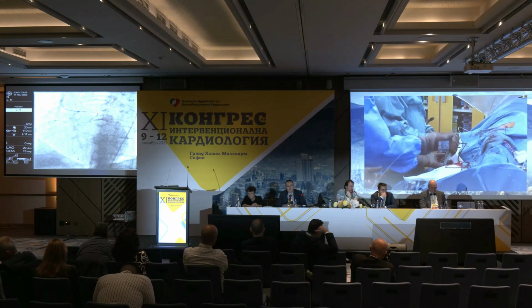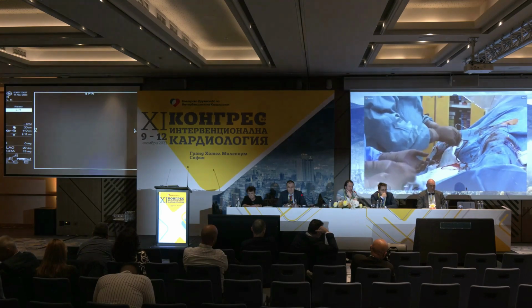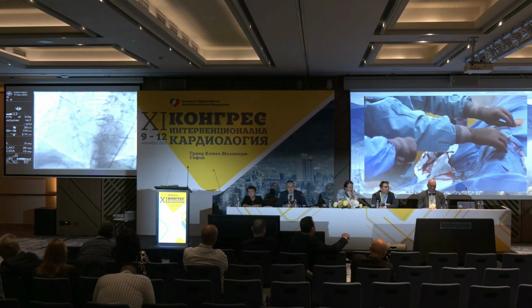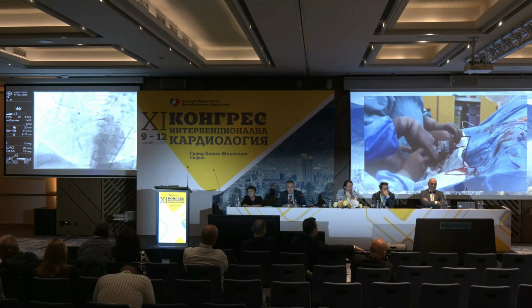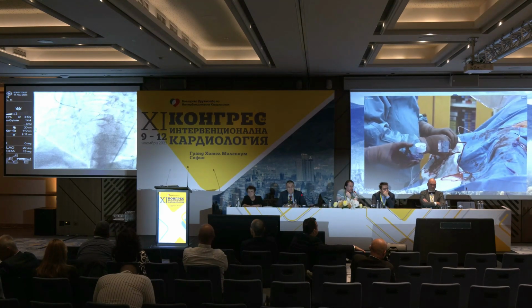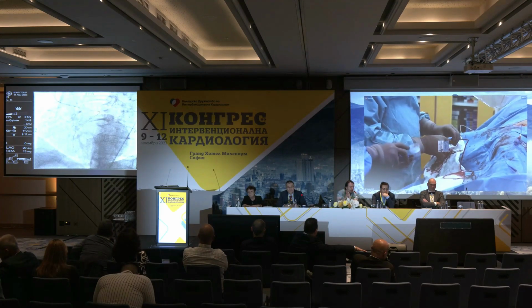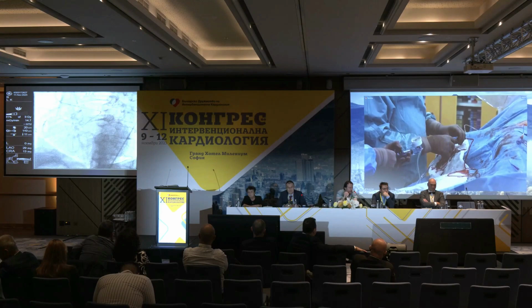Or sometimes you lose the loose end, so you always put the torquer there. And as you see, we always keep this wire outside the left main, just to make sure that it will not compromise. Let's see whether this balloon will cross. No problem. All these tricks mean we have done this all previously. So that's just experience, isn't it, George?